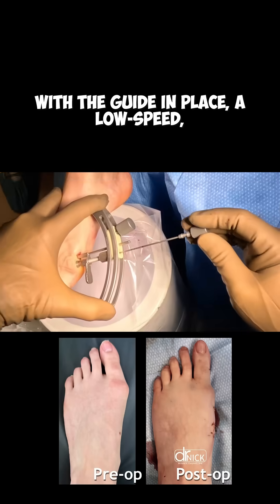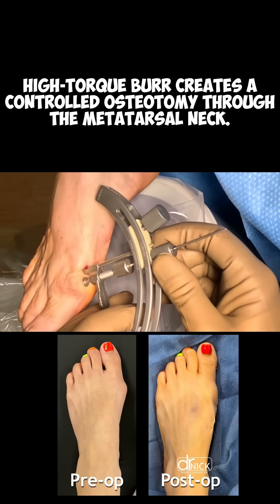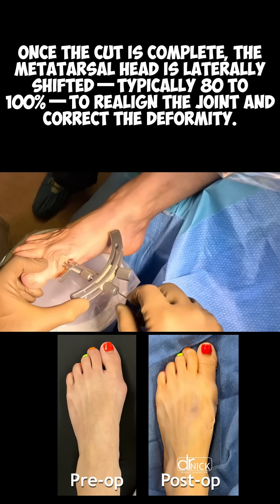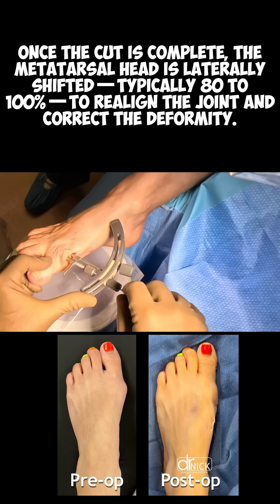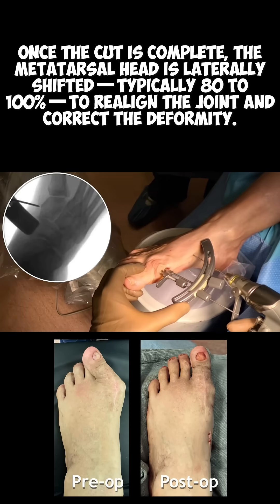With the guide in place, a low speed, high torque burr creates a controlled osteotomy through the metatarsal neck. Once the cut is complete, the metatarsal head is laterally shifted — typically 80-100% — to realign the joint and correct the deformity.